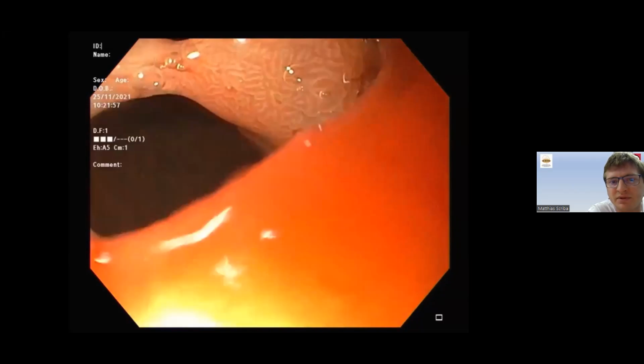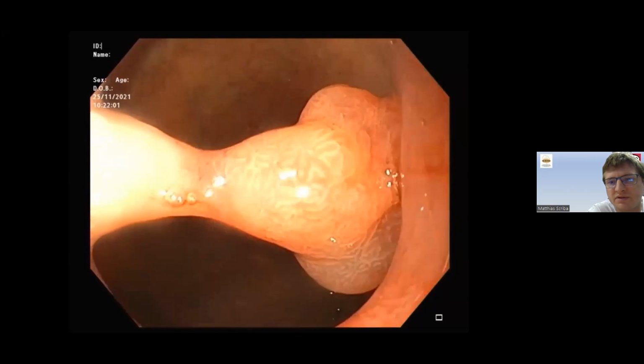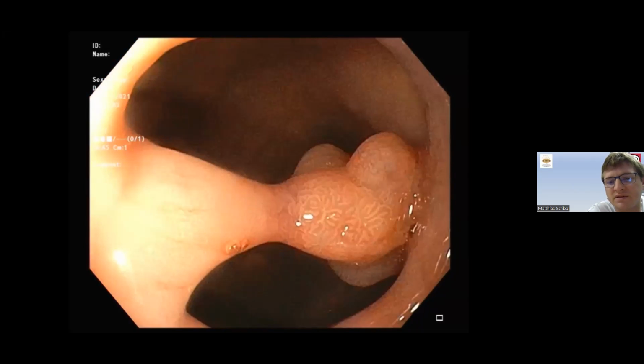And as Galia said, because it's been waving about, the tip was slightly ulcerated. It's not so easy to see here, but that's a good reason why this patient was anemic. So we're going to carry on talking about hyperplastic polyps, and then just now I'll show you what we did for this case and how it ended.